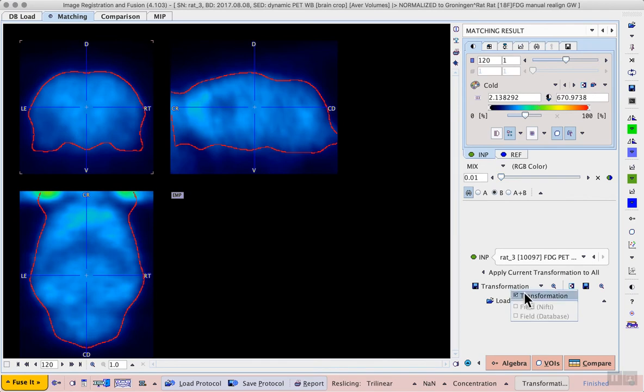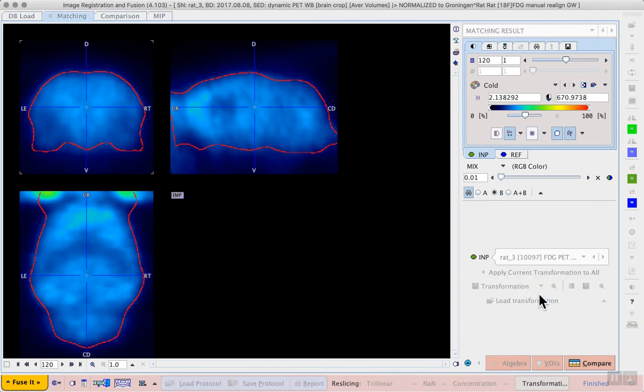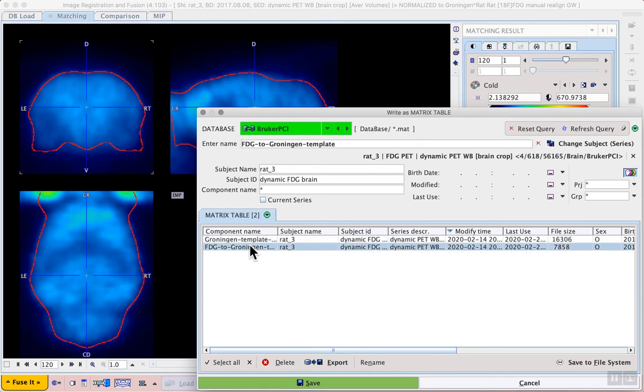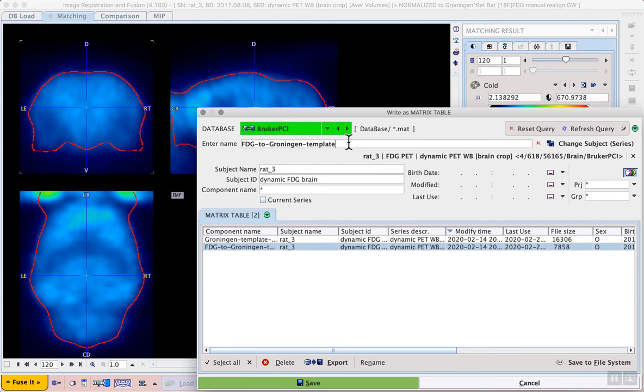The Save Transformation button is on the lower right, allowing us to save the transformation to the database. In this case, the transformation we're saving corresponds to the one we have pre-saved for you. This will be the individual FDG matched to the Groningen template. And to distinguish the data, I will label this as the test.